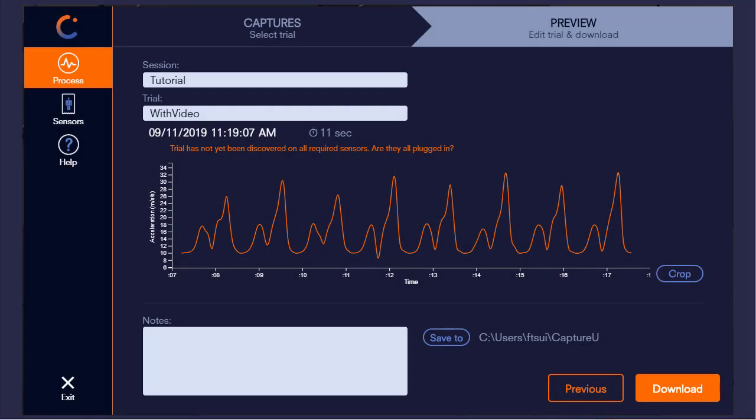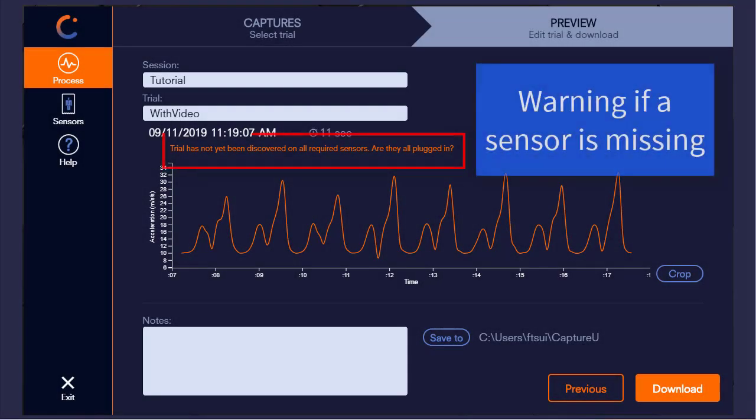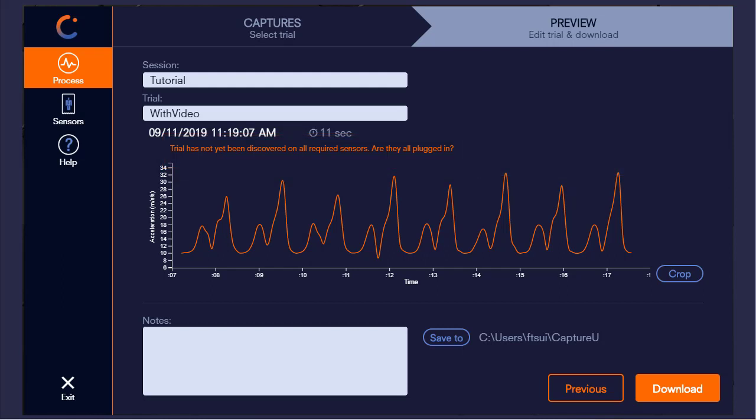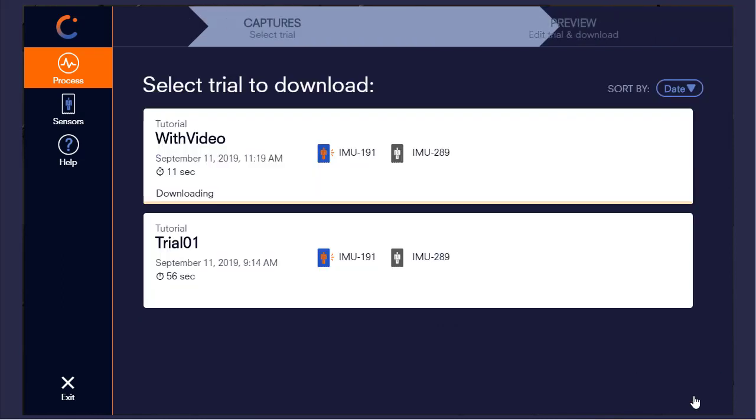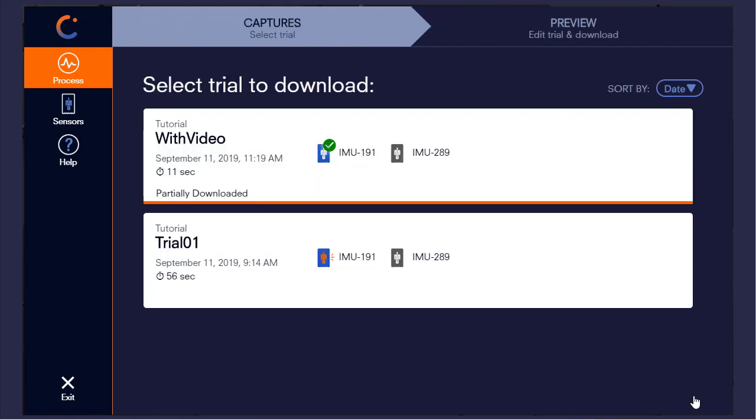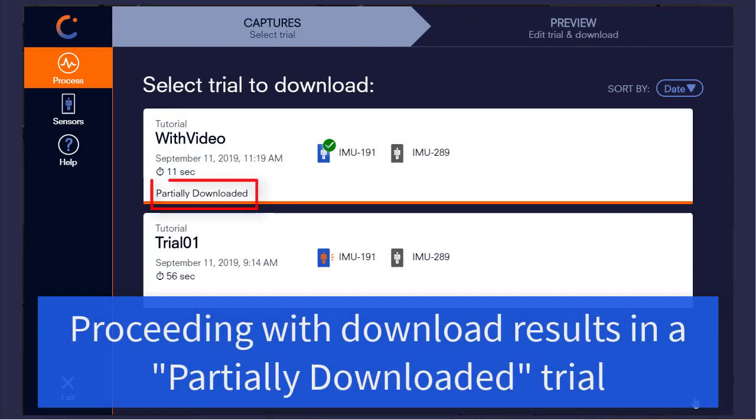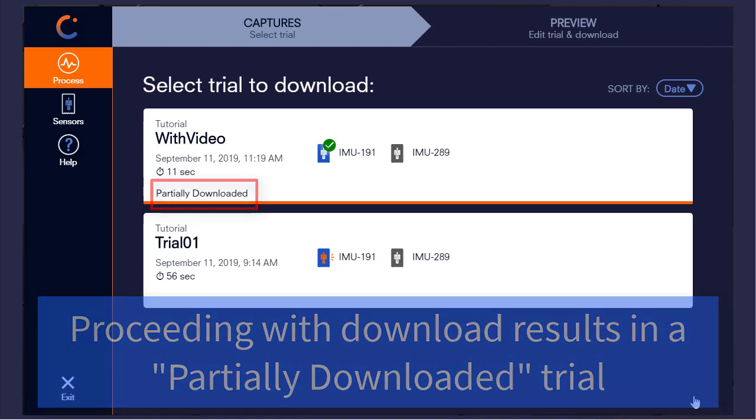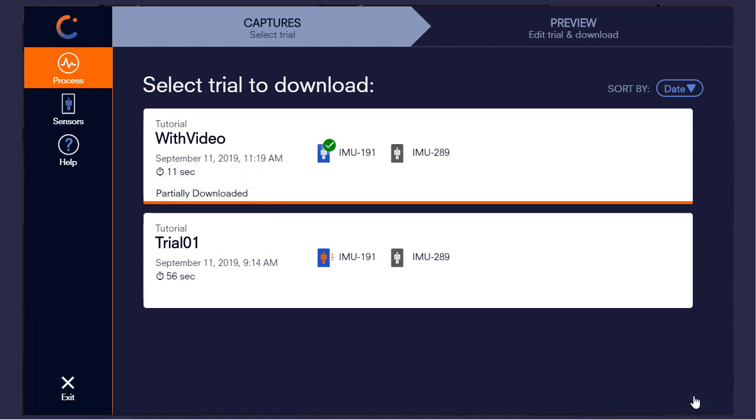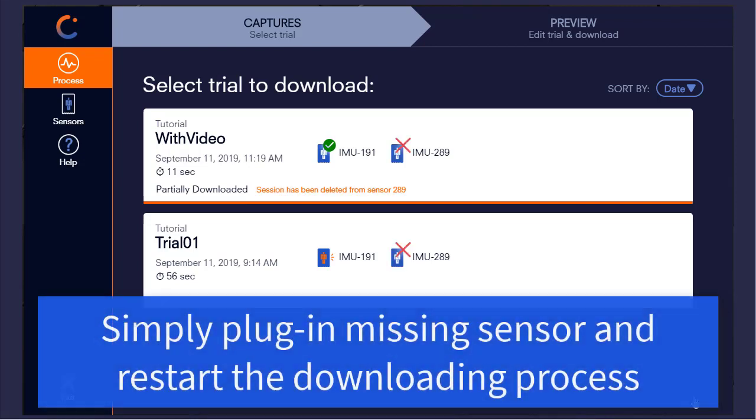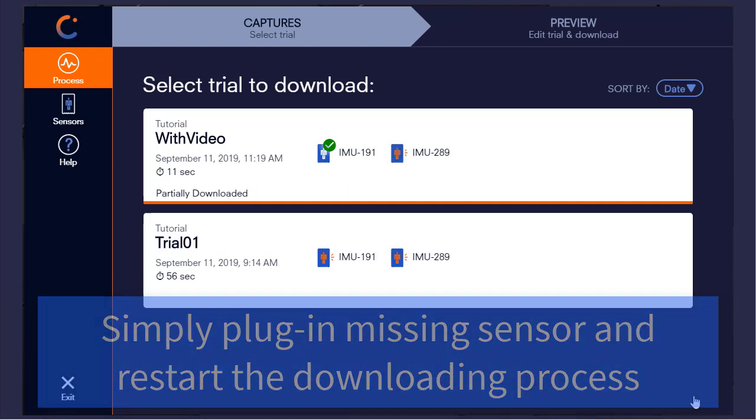If you had only plugged in one of the sensors, we would see a warning appear that not all sensors are present for the trial. After clicking download and returning to the trial list screen, we are warned that the trial was only partially downloaded. We can also see the status of the sensor is disconnected. We can now plug the other sensor in and restart the download process.